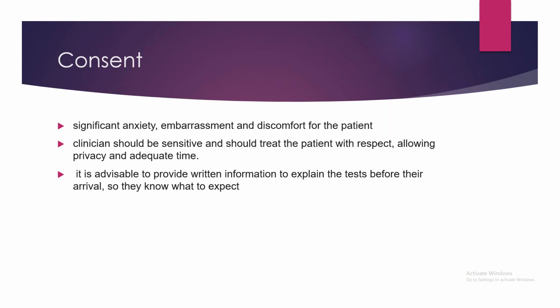Okay, it is advisable to provide written information and to explain the test before their arrival, so they will know exactly what to expect during this test. Otherwise, if they suddenly arrive for the urodynamics and then you are asking them to void in your presence, it will be very embarrassing for them. Okay, so you should inform them exactly what is to be done in that test.